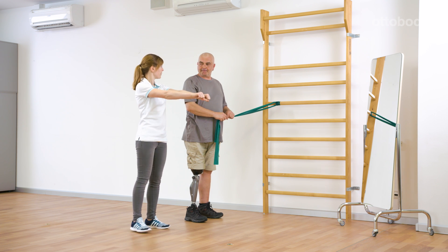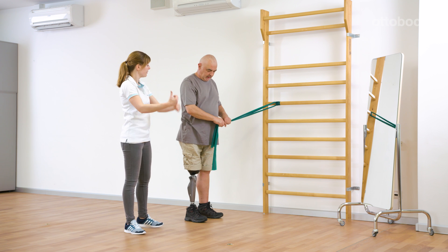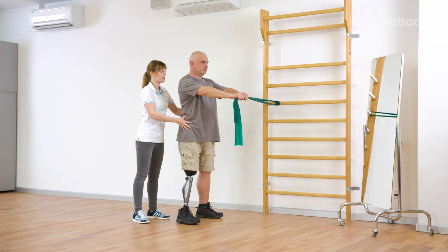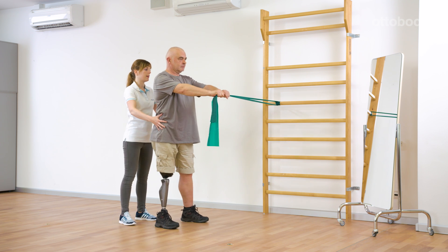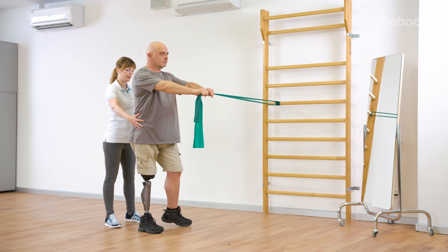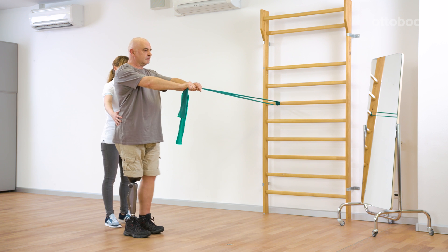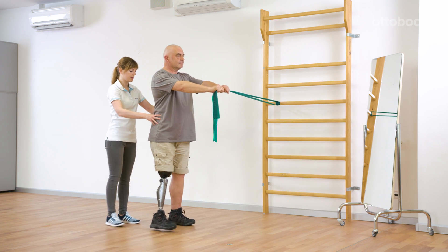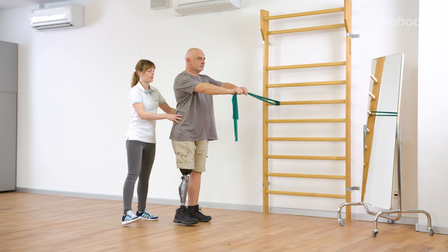Now from the same starting position, side steps are carried out. Gerhard executes the exercise as far as he can keep the position of his arms and upper body. This requires great tension in the core muscles. The hip abductors are required at the same time. Good core muscles are essential for a safe and dynamic gait.